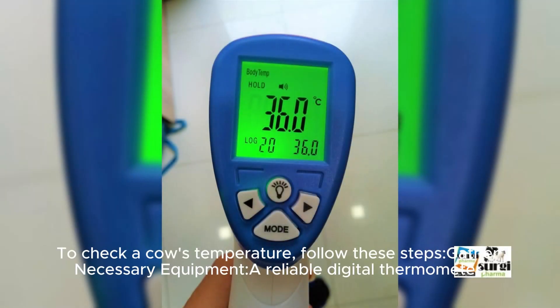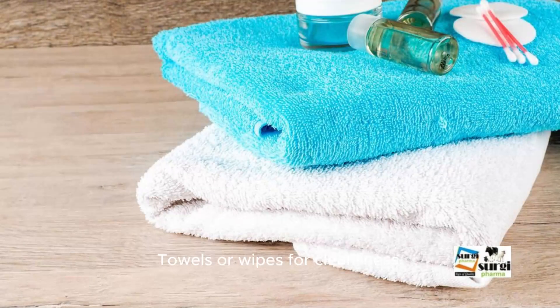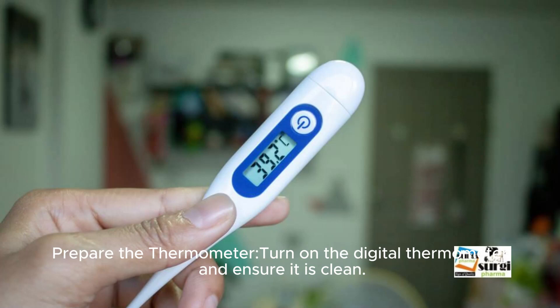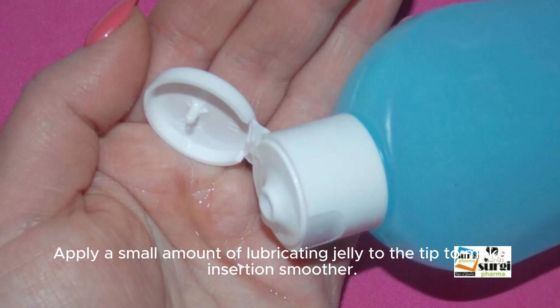To check a cow's temperature, follow these steps. Gather the necessary equipment: a reliable digital thermometer, lubricating jelly or petroleum jelly, and towels or wipes for cleanliness. Prepare the thermometer by turning on the digital thermometer and ensuring it is clean. Apply a small amount of lubricating jelly to the tip to make insertion smoother.